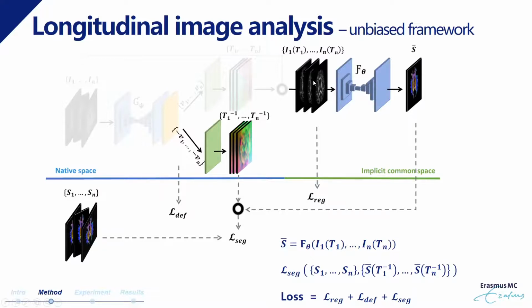First, information from all available time points can be jointly utilized for image segmentation, which results in less random error compared with cross-sectional segmentations. Second, a common segmentation is obtained in the common space, ensuring spatial correspondence of the segmented structures across images, which means that the variation in segmentation can be fully explained by spatial deformation rather than classification error.